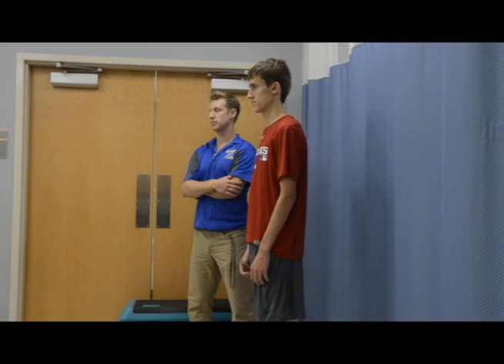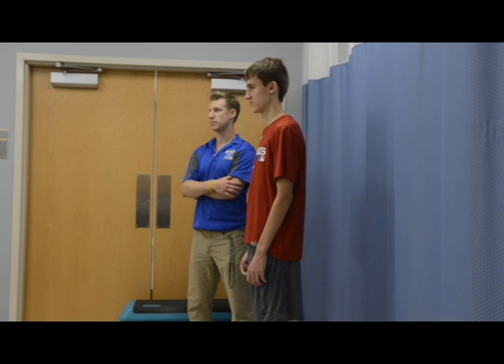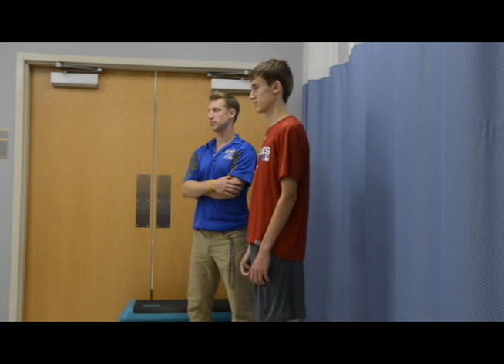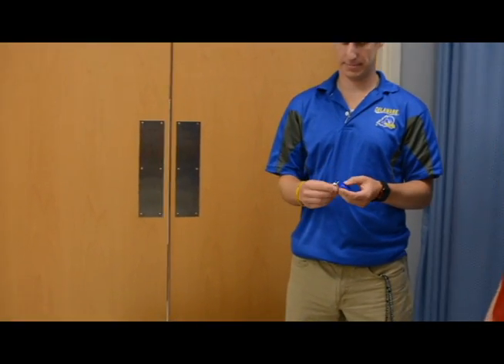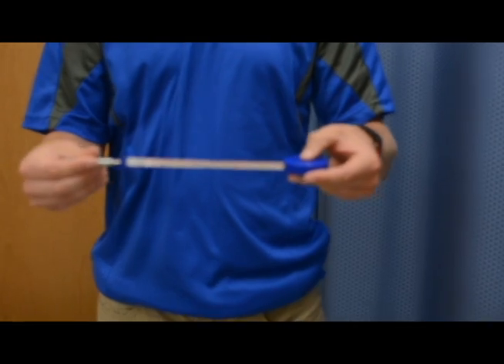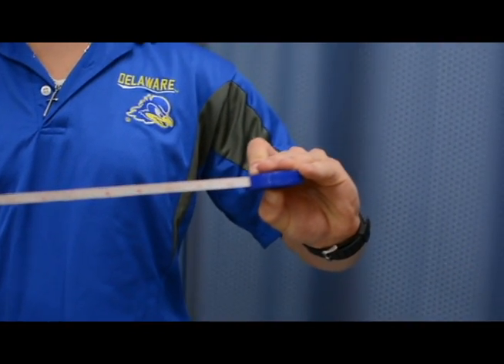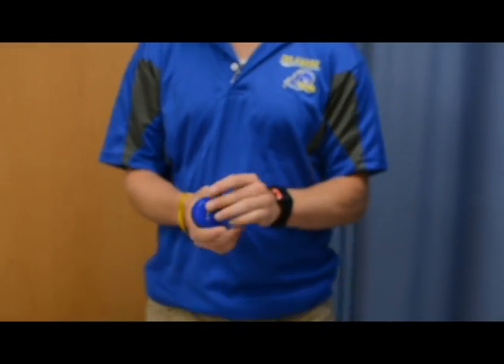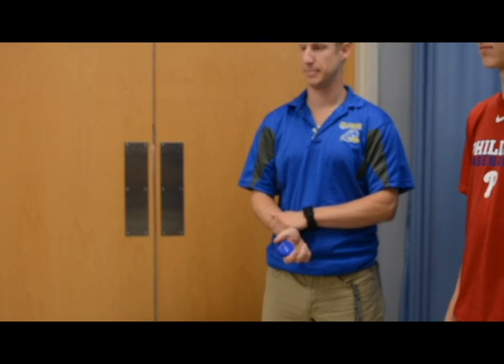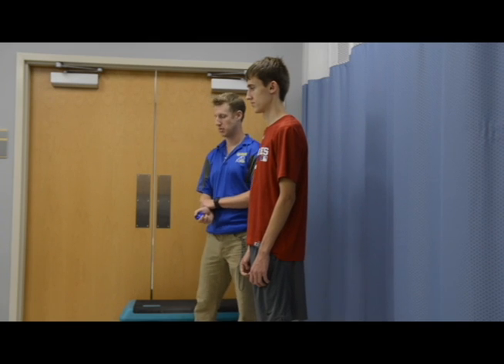However, before we get into that demonstration, we need to go over how to use proper technique when taking these measures. To take these measures, we use what is called a Gulick tape. This is a spring-loaded tape that reads both metric and standard measurements. The measurements that we take will be done while slightly compressing the subcutaneous fat around the measurement site, but we will explain this a little bit more in depth once we actually demonstrate the measures.